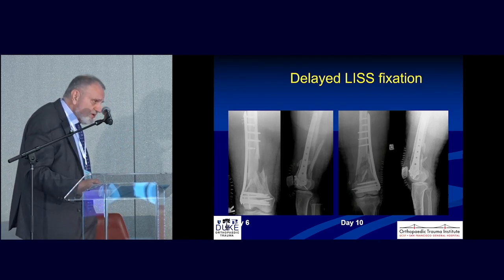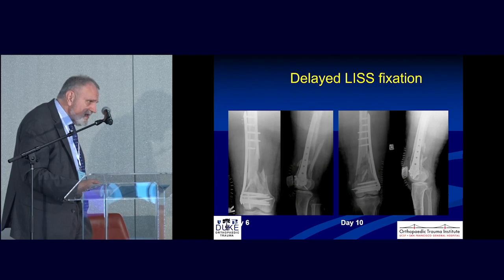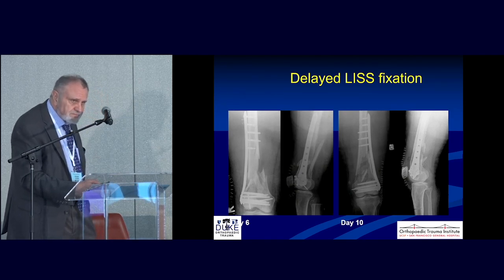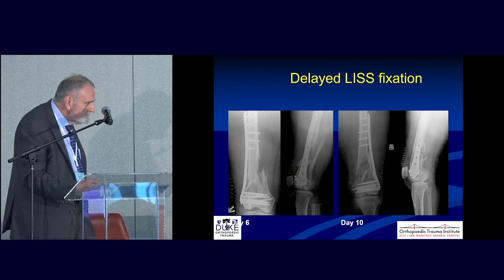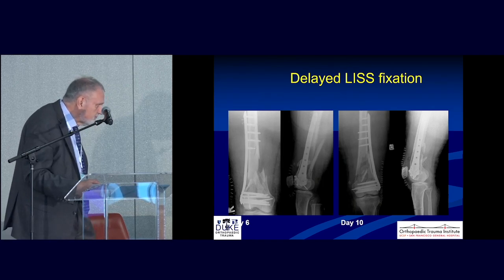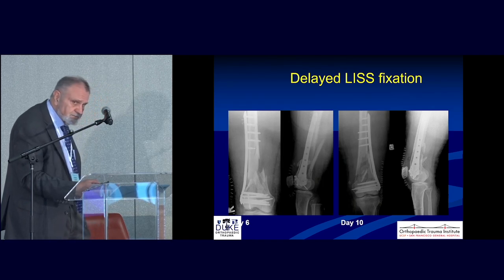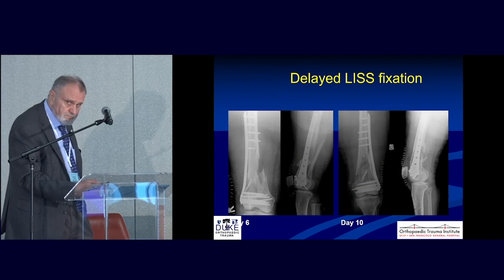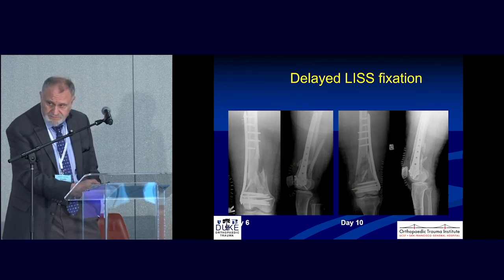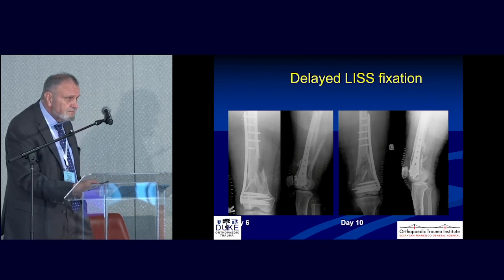Tourniquet, no tourniquet? No tourniquet. If you need one sterilely, you can put it on, but no tourniquets. And you want as much blood flow down there as possible while you're doing the operation. And the question is, do you graft these, given comminution? I did not. Anybody acutely bone graft? No acute bone graft. Okay, so no acute bone grafts. Anybody else? How about fake bone? No. Anybody want to stuff some stuff in there?